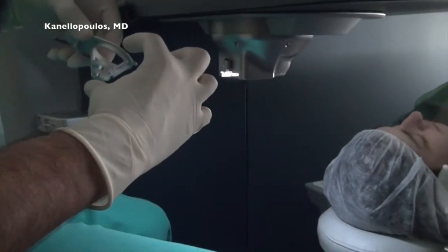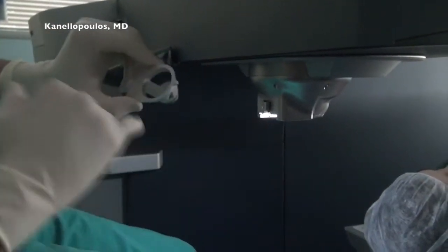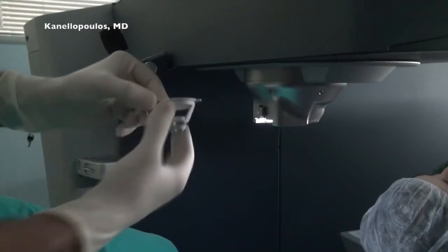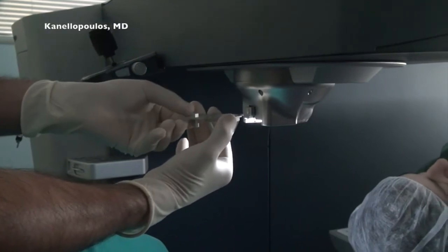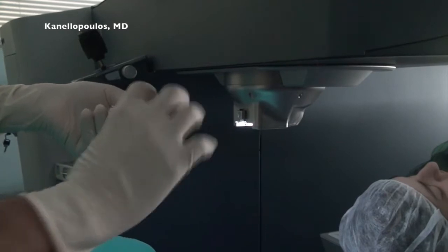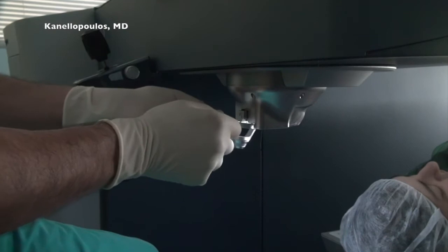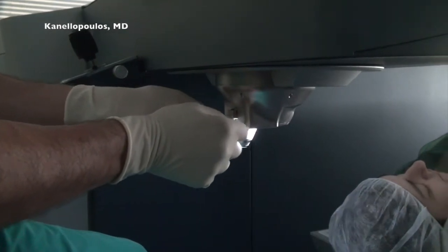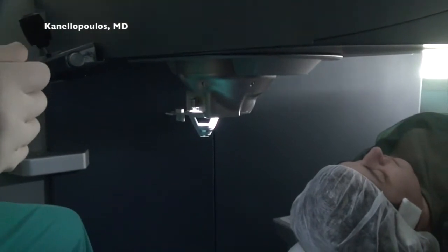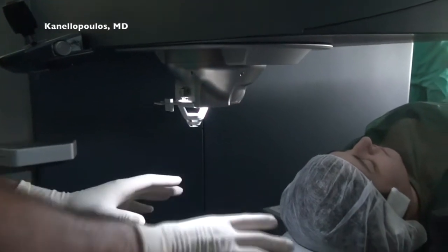We can see that it comes calibrated from the factory, but the FS200 recalibrates each given patient interface every time it's placed in the laser apparatus. So it has a hyper-reflective surface, and then the laser calculates the distance of the PI, for patient interface, validates its accuracy, and gives us the go-ahead. So thus the parameters are absolutely pristine.